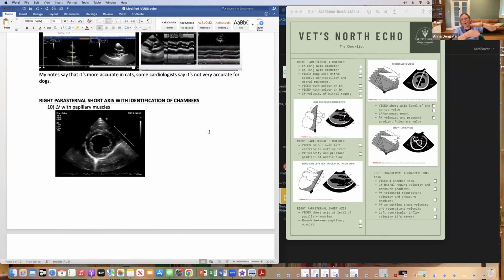So now we've gone from 9:30 to 10:30 on our dog. This is the spine. This is the probe. We're going to go to 9 o'clock. So we're pretty much gone. In fact, it's probably close at 8 o'clock. We're pretty much gone a full 90 degrees from where we started.